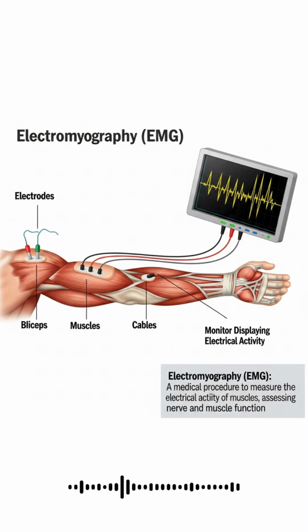As an example, let's pretend that someone hears a beep and then presses a button. EMG can break up that reaction time into two parts. First, there's a premotor time, the short delay between the beep and the moment the muscle starts to activate. Then there's motor time, the time from when the muscle activates to when the movement actually happens. This kind of detailed information helps us understand not just how fast someone reacts, but how their body prepares and carries out that certain action.